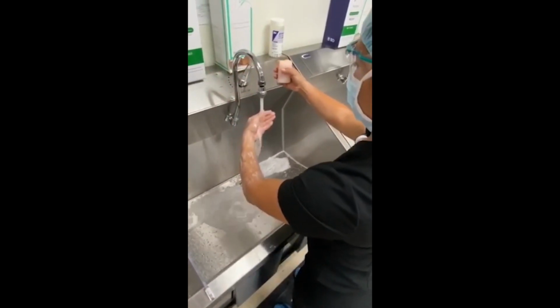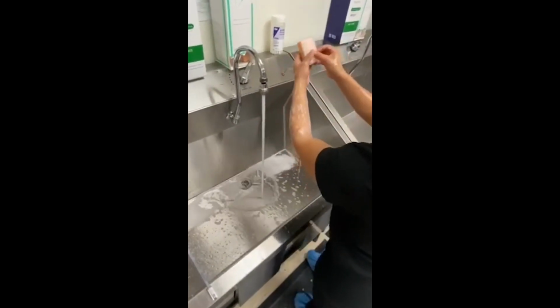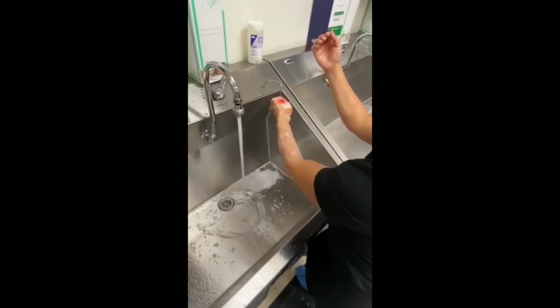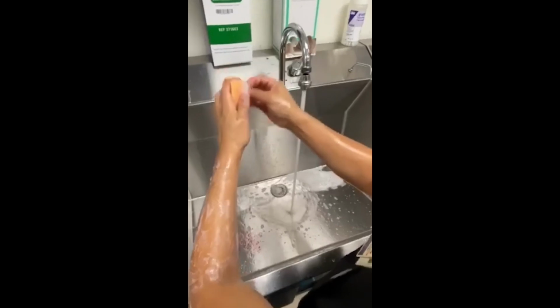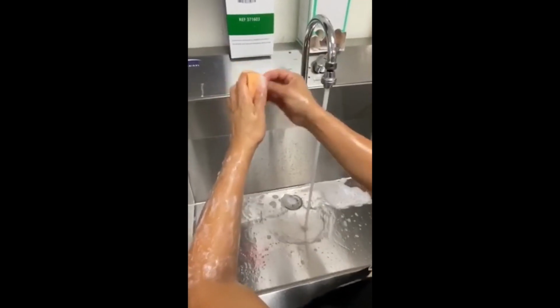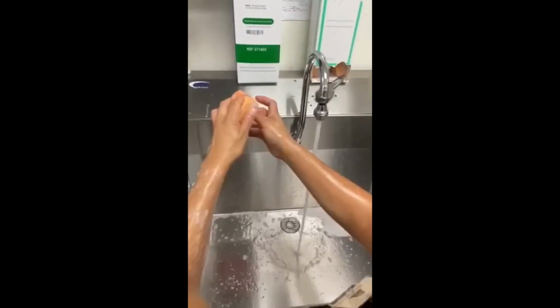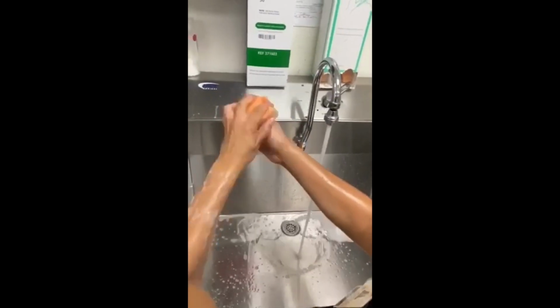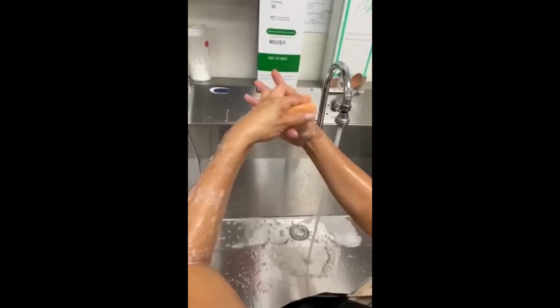Once she has completed the scrub all the way up to the elbow, she rinsed the brush, rinsed the hand only, and switched hands. Repeating the same method of applying more soap to the brush and going to the hand that is not yet scrubbed. We do not rinse the arm, only the hand. Again, we still want that soap there. Same steps as before: all fingers, nails, and in between.